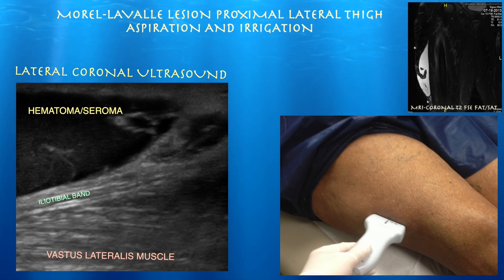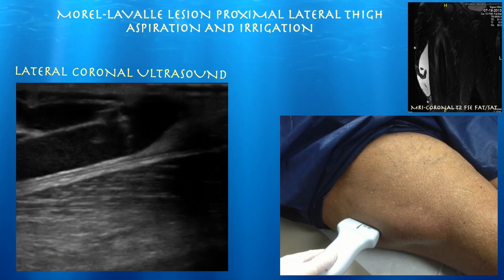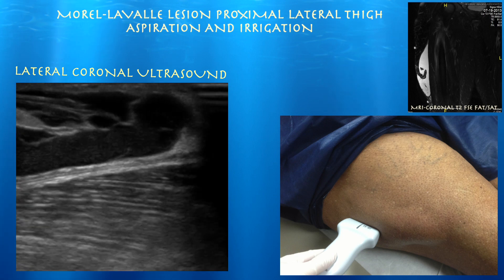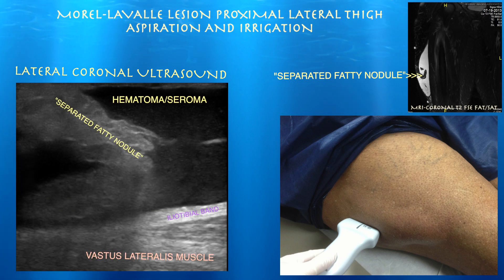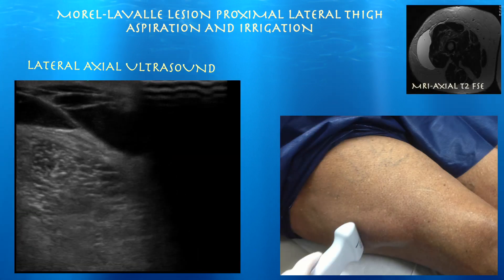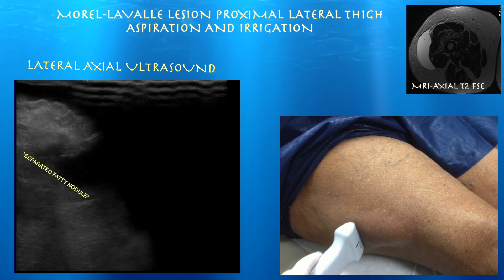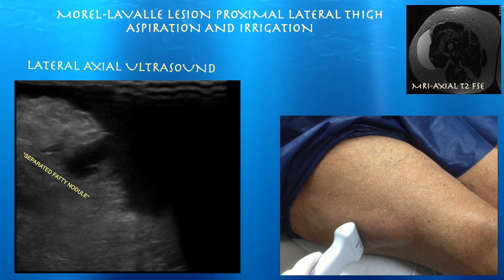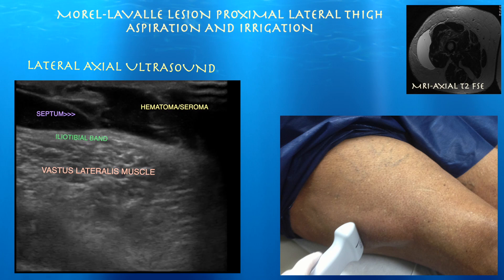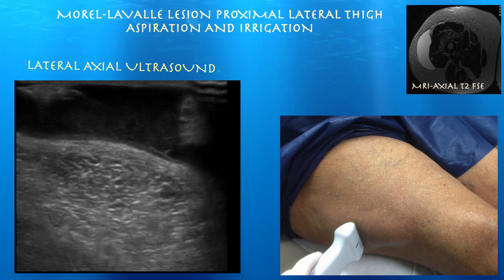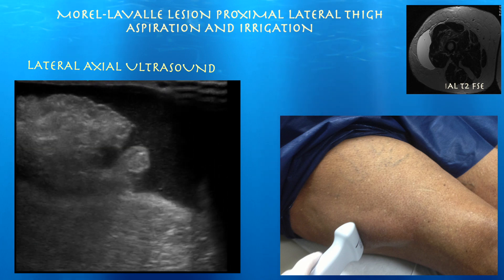Here we're doing a lateral coronal ultrasound where you can see this very large hematoma right above the ITB band. Some fat has become separated from its normal position and is basically hanging inside this large fluid collection. In axial view, here's that fatty nodule. We can also see a septum within this Morel-Lavallée lesion, and there's more fat coming into play.